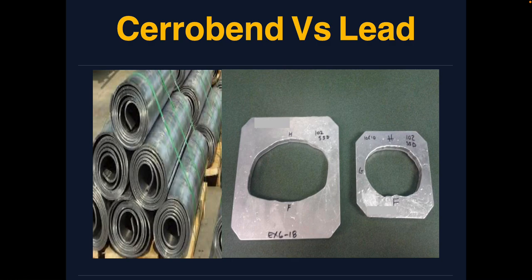But you may need to calculate it when you need a certain thickness of lead to be inserted in a narrow area. For example, under your lip, there is no space, and you will need to cover the lead with wax. This wax will have a thickness, so you need to calculate the thickness of the lead properly so that you can insert it in a proper way. But the rule of thumb for protection for electron beam is E divided by 2 and add 1 will give you the thickness in millimeters.